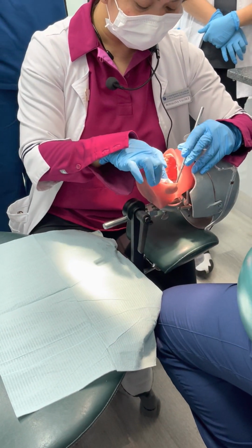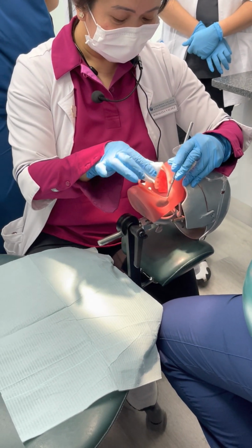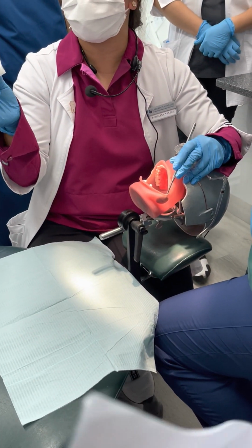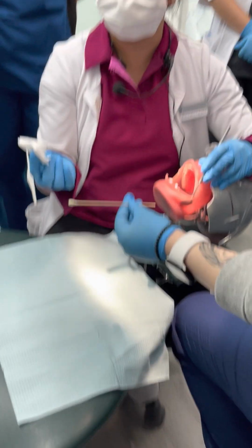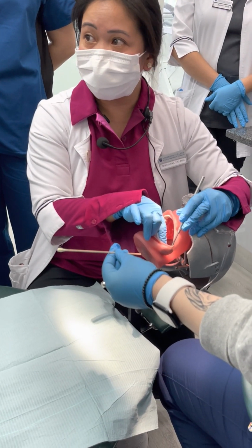What's next? That's the cotton tip applicator. You know what that is? Piece of paper. So why am I drying it? Why do I need the gauze this time? To dry it. So you have to make sure you know what it is for. Why am I giving the gauze?